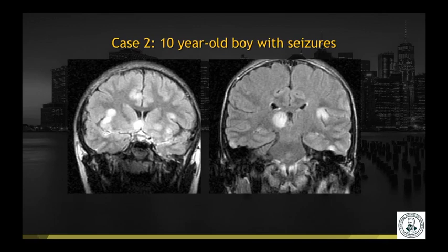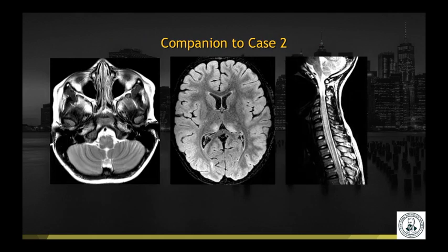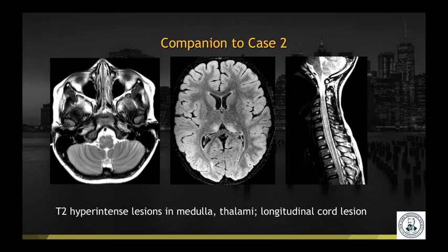Case number two: a 10-year-old boy with seizures. Coronal T2 FLAIR images show T2 hyperintense lesions involving both the white and grey matter as well as the deep grey matter. A companion case with axial T2, axial T2 FLAIR, and sagittal T2 from the cervical spine demonstrates T2 hyperintense lesions in the medulla, bilateral thalami, as well as a longitudinal cord lesion.